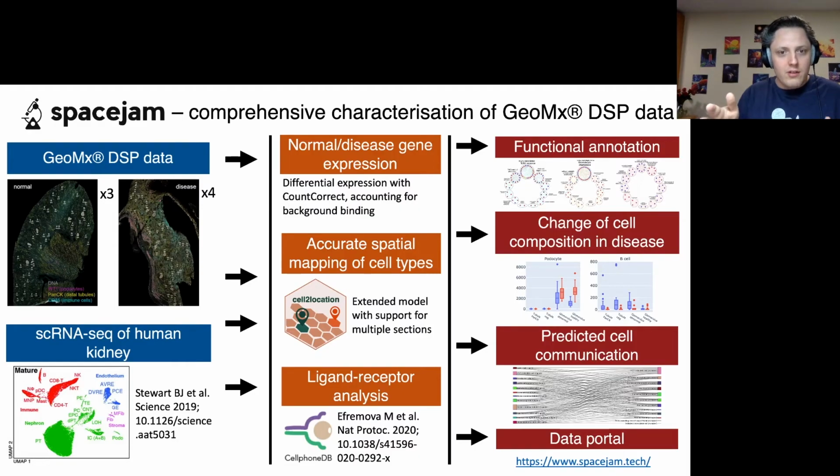We put all of this information together into a data portal, which makes it much easier to explore the complexity of data produced by these methods.